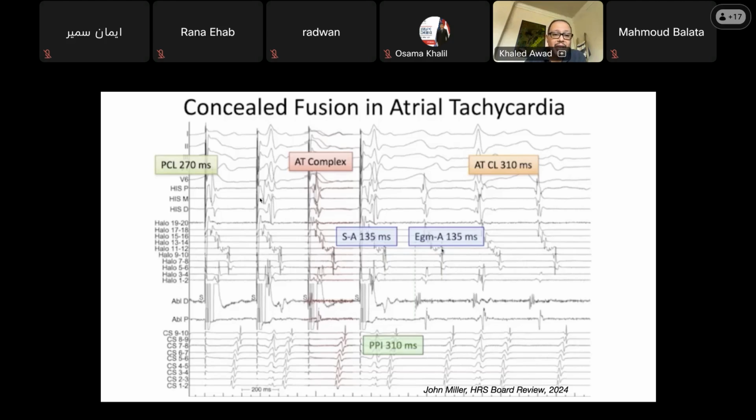This particular arrangement is essentially a P-wave morphology of a different type. This is something that looks like a P-wave. It is not a P-wave. It is an interatrial signature for a particular pattern of propagation. This is what that looks like, okay? If I alter that by pacing, then I fused. I fused what? I fused what I changed in the atrium based on pacing to what the tachycardia was making the atrium do based on its own propagation. So I can fuse my influence and the tachycardia's influence.